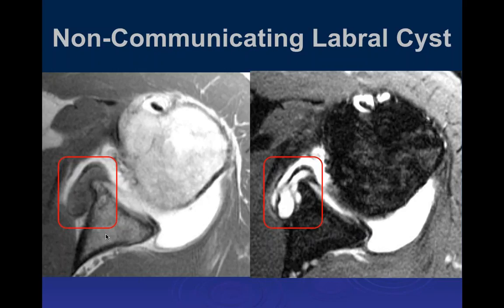Yes? How long does it typically take all of the contrast to resorb? Well, typically, 24 hours later, you will not see bright signal intensity on a T1 weighted image. If you put in undiluted contrast, which occasionally people have made the mistake of doing, and then you get MR images, I think I showed this in the knee, it's all black on all the pulse sequences.